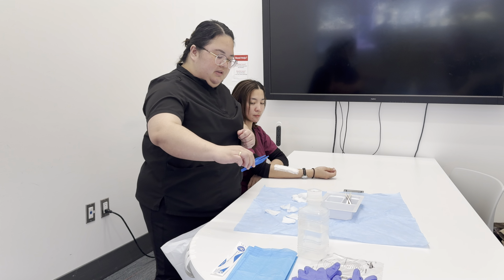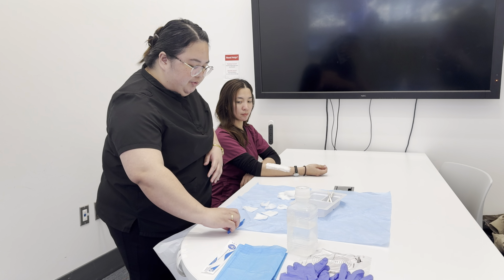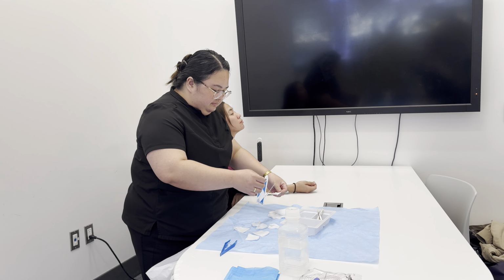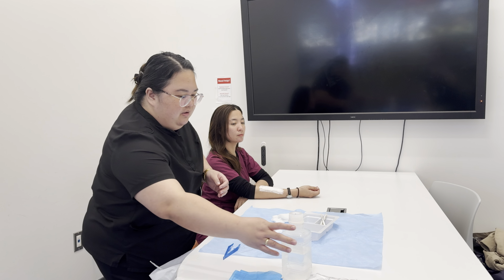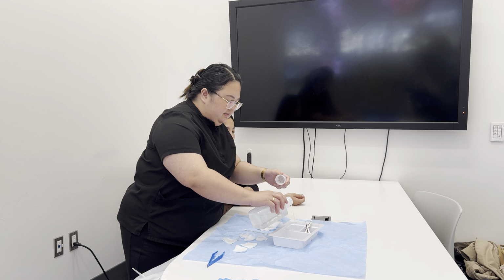Then I'll put at the side the sterile forceps, maintaining a 1-inch border. Then I will put the Q-tip on the pad. Same with the saline. We'll put a little saline in the container.